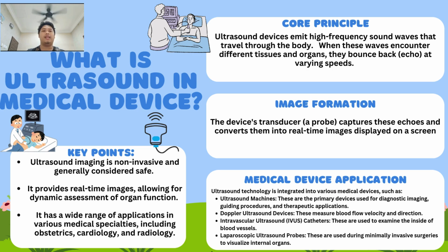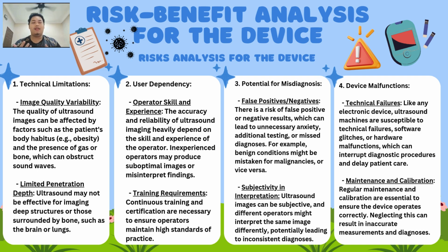So, here are the key points. Ultrasound imaging is non-invasive and generally considered safe. It provides real-time imaging, allowing for dynamic assessment of organ function. And it has a wide range of applications in various medical specialties, including obstetrics, cardiology, and radiology. That's all. The title we chose for the case study is ultrasound, by group 5.